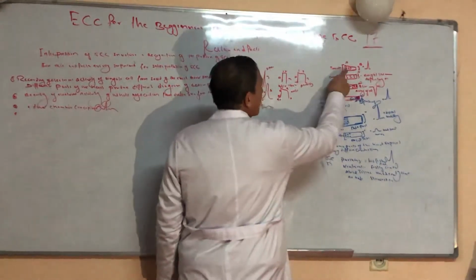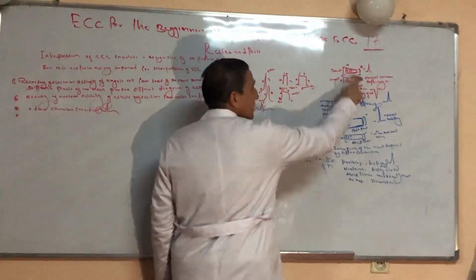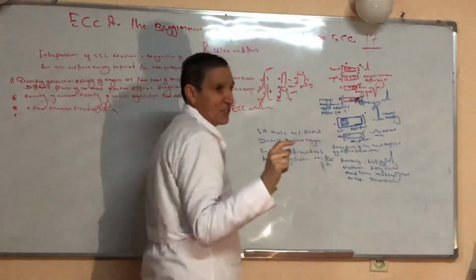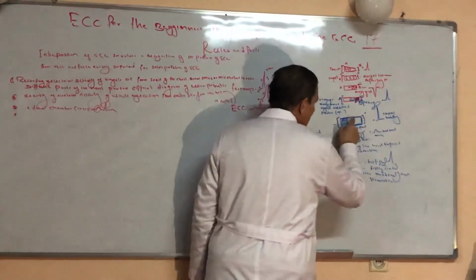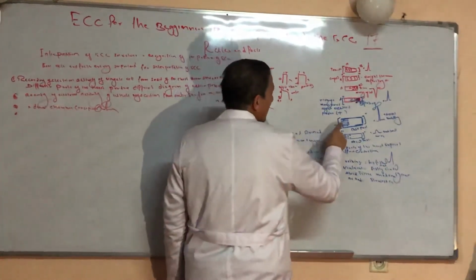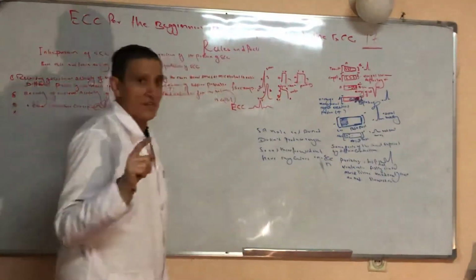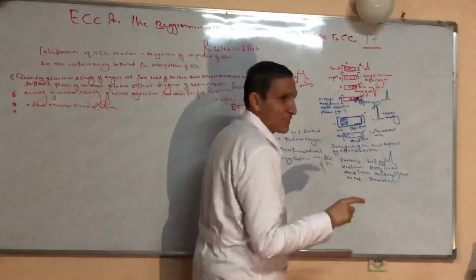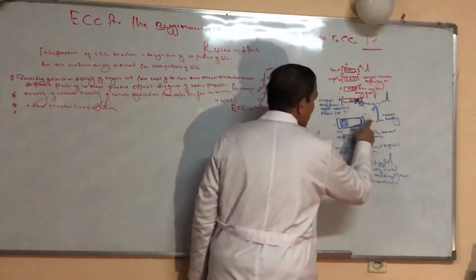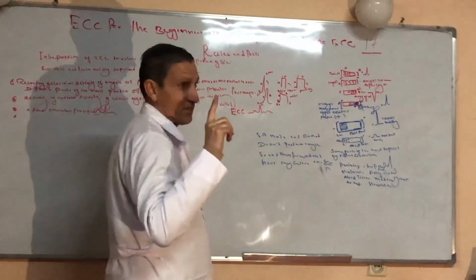Remember, in this case, the positive charge moves toward the positive electrode, so the deflection in the needle would be positive. But this is a small piece of tissue, so it produces a small deflection. Right now we have a large part of the myocardial tissue, the left ventricle. When the positive charge moves toward the positive electrode, the deflection in the needle is positive, but strongly positive. That is why the left ventricle exerts more influence on the ECG compared to the rest of the heart.